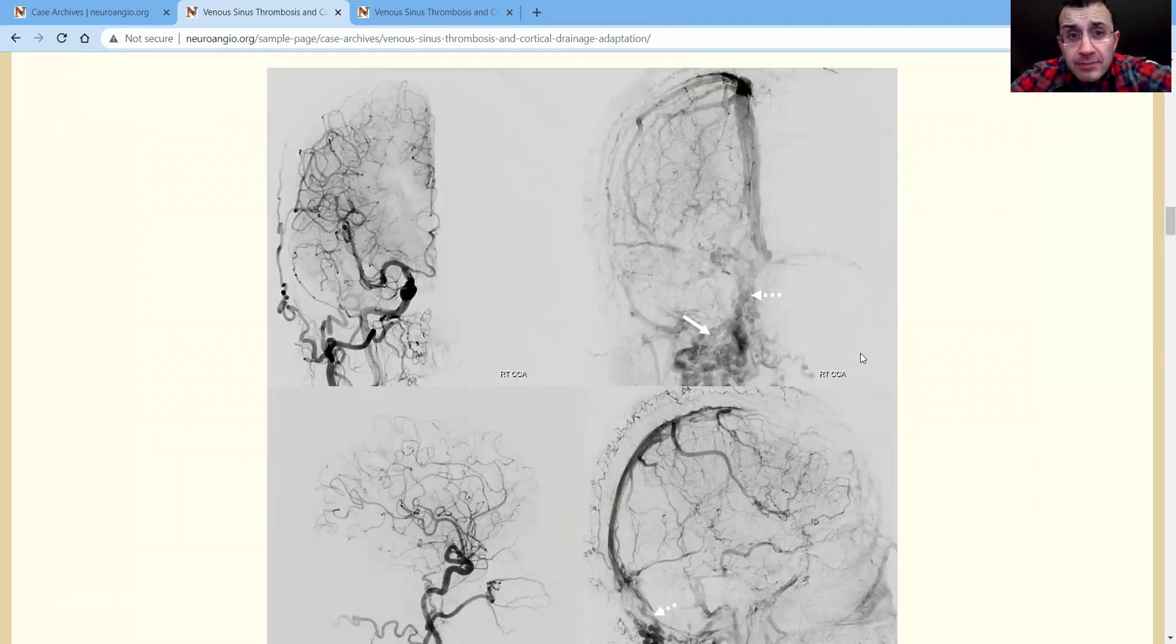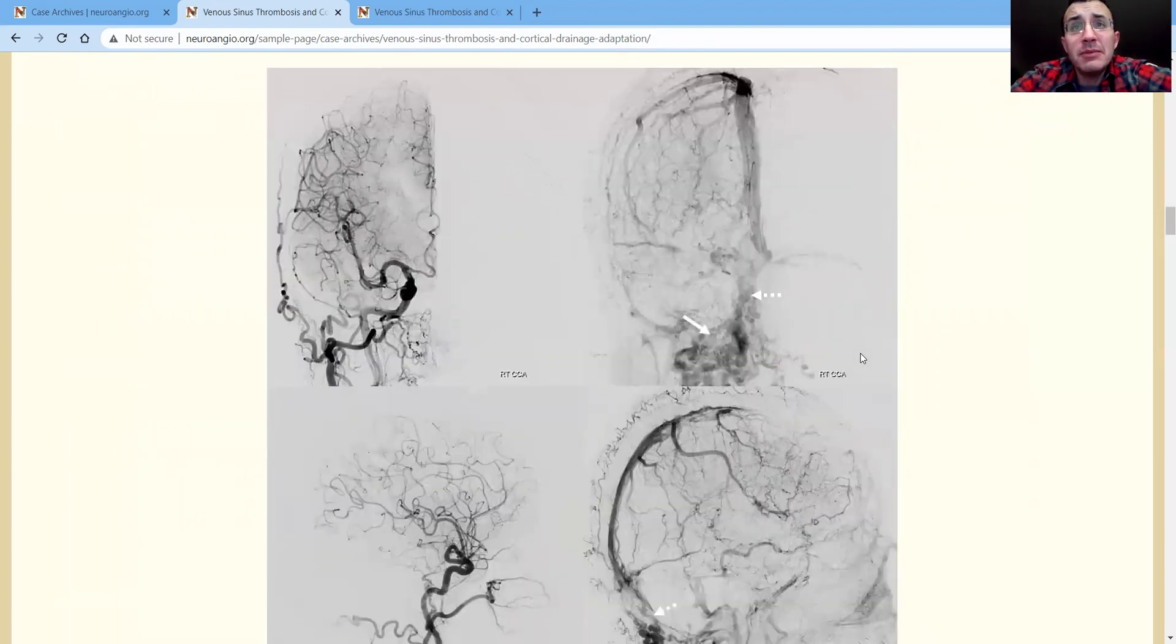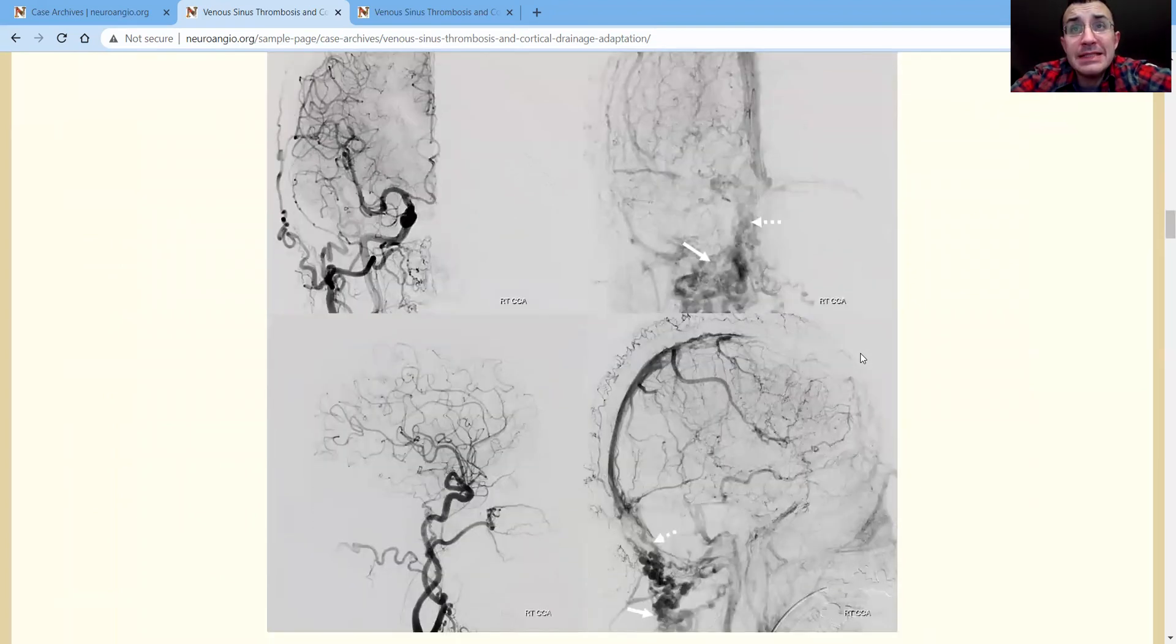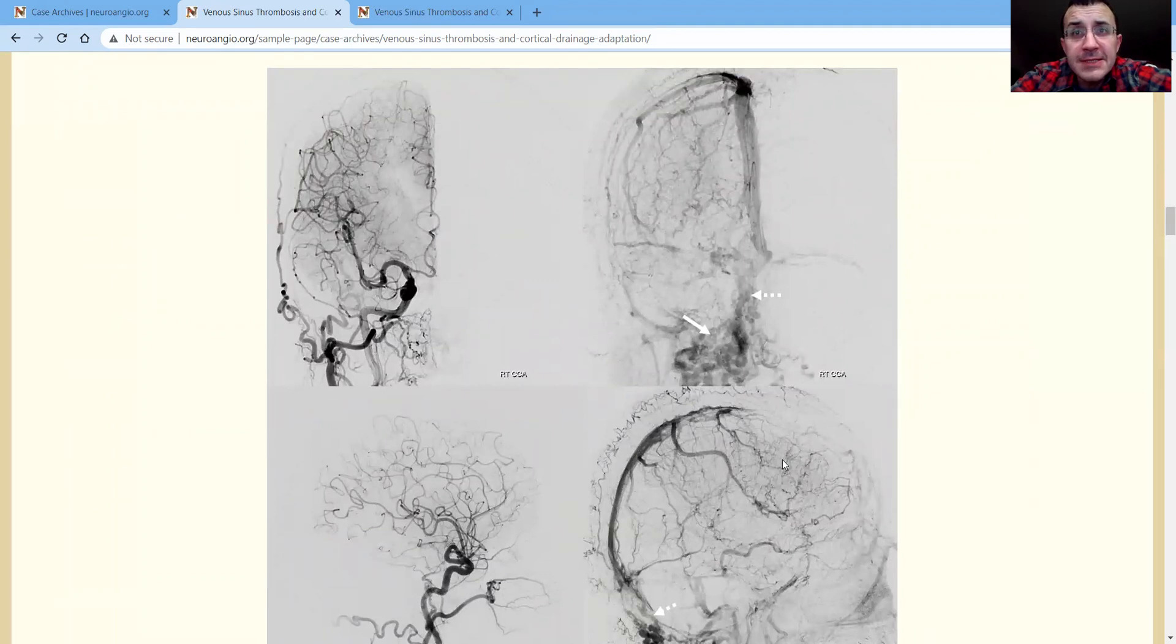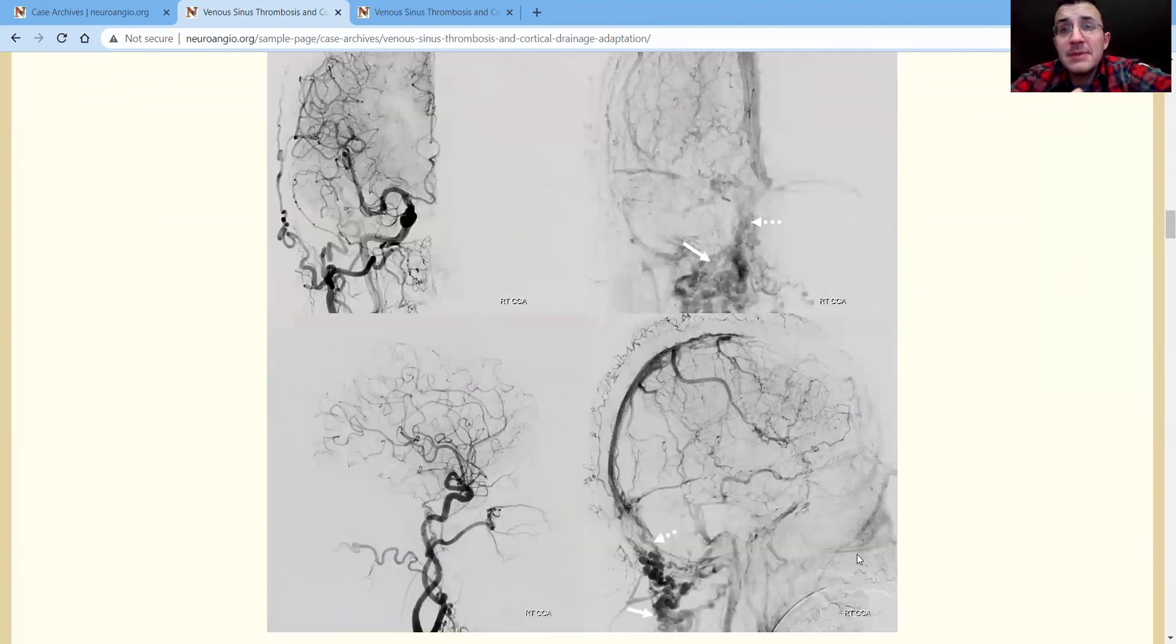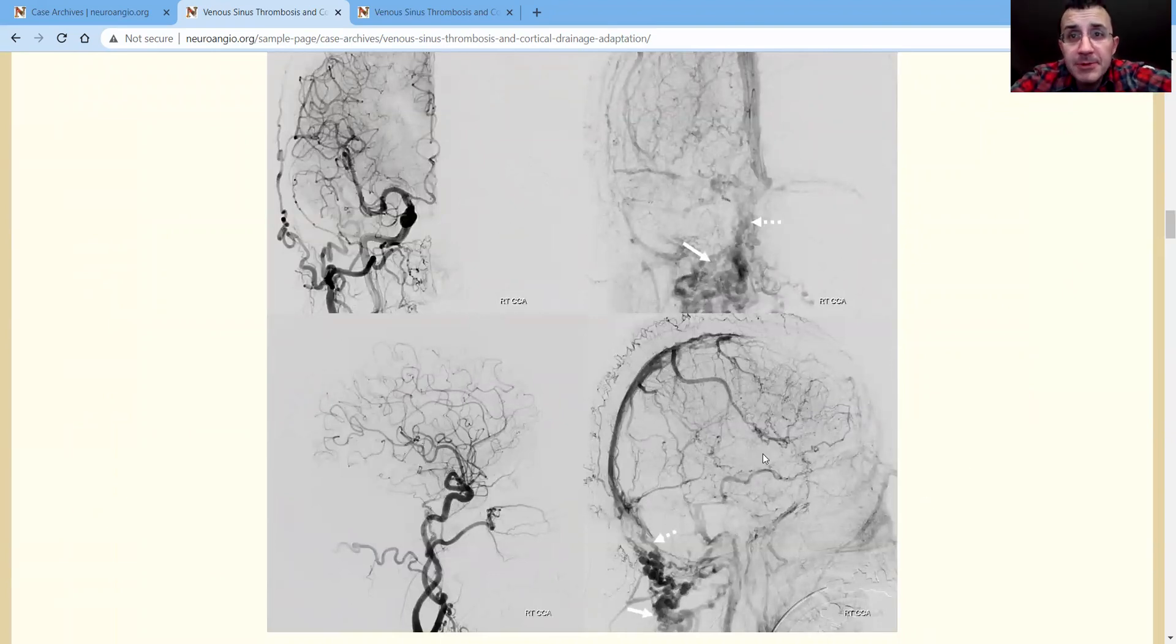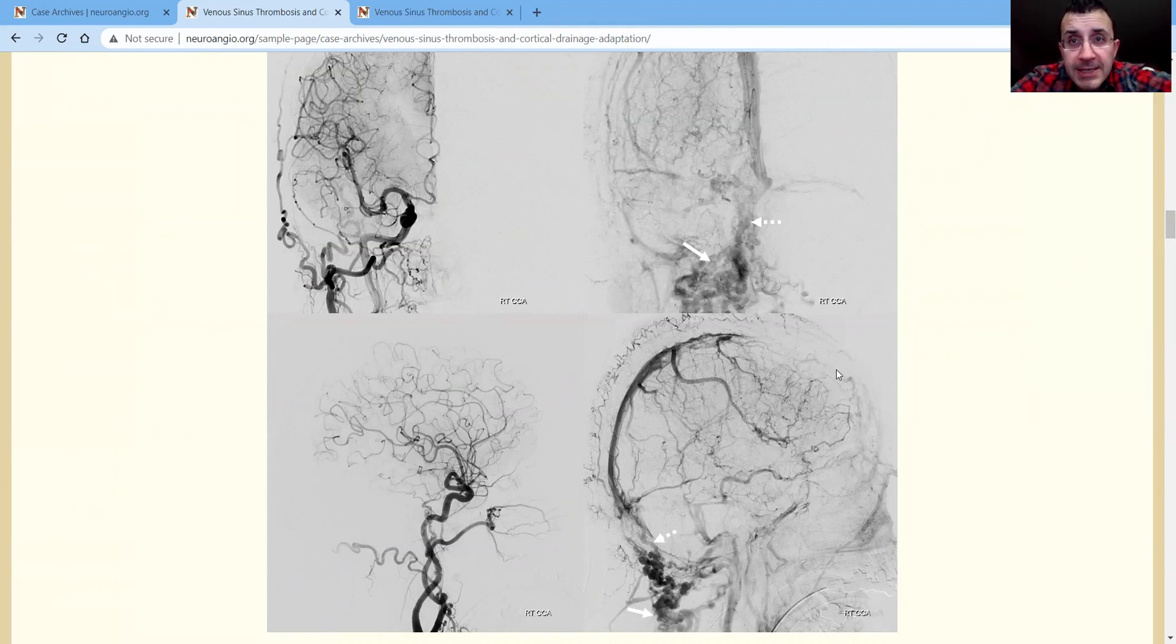Now, we're going to put this together, the MR, the CT, and the angio. So what do we see on the angio venous phase injection? A lot of stuff here, but we're going to take it all together. So to analyze that, look at the frontal lobe. What's happening here? Obviously here's that thrombosis in the sagittal sinus. Now, where is the lobe going to drain?